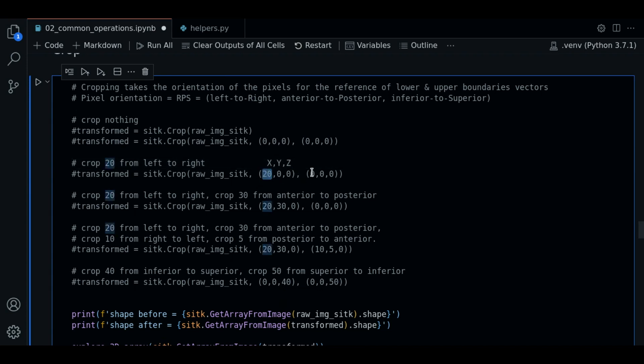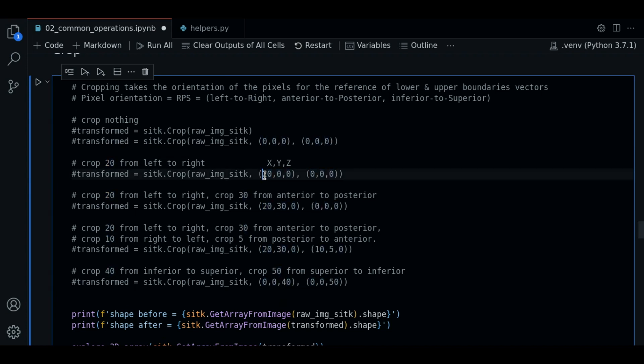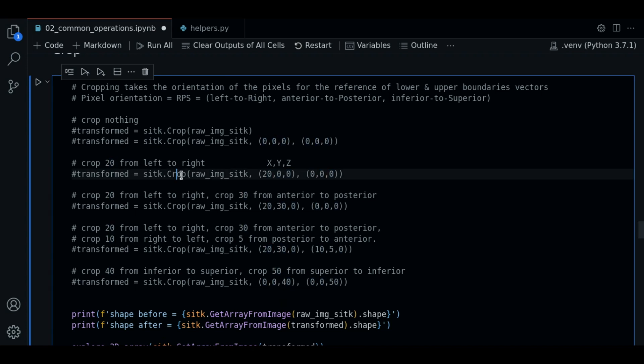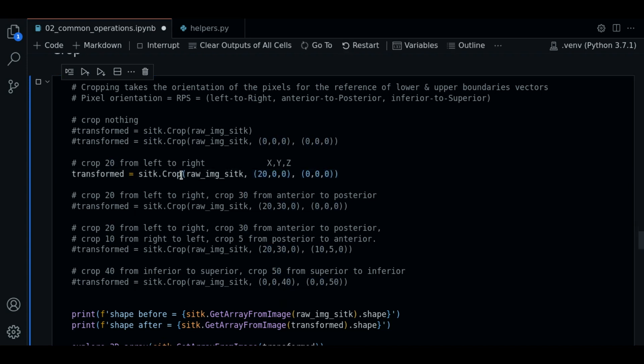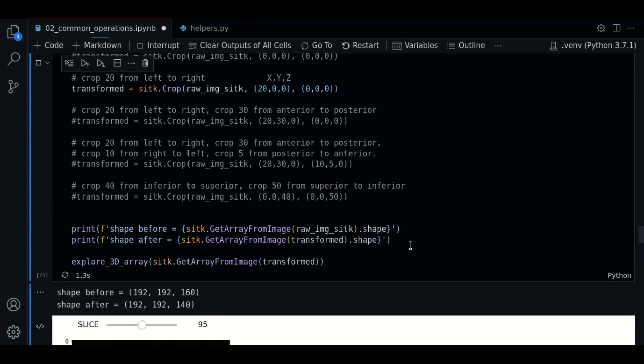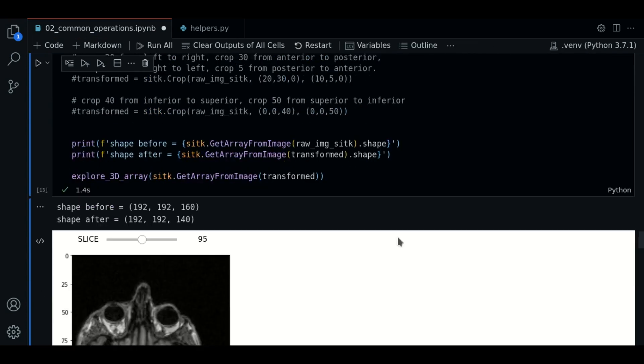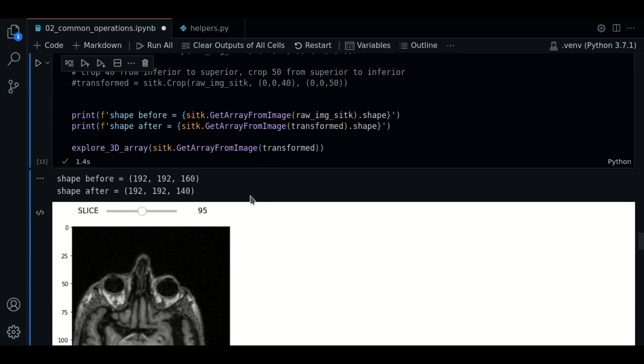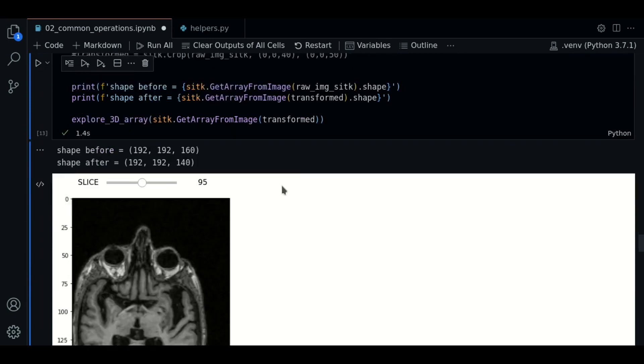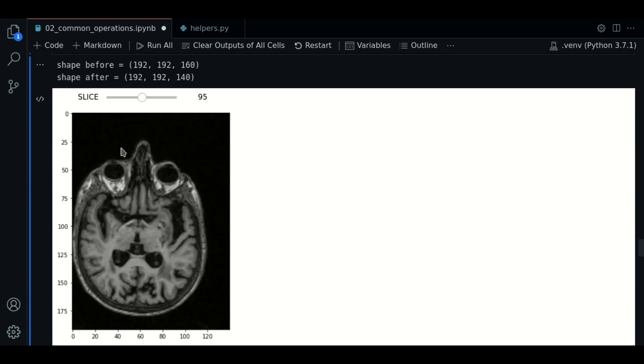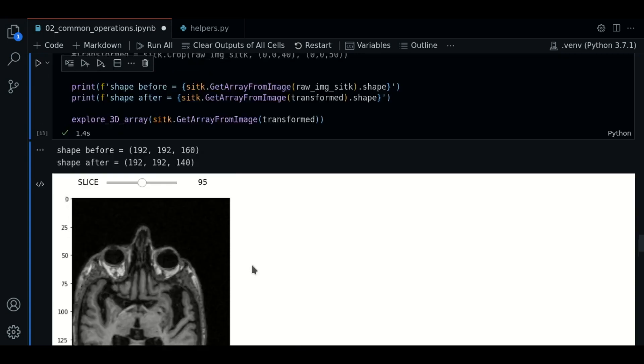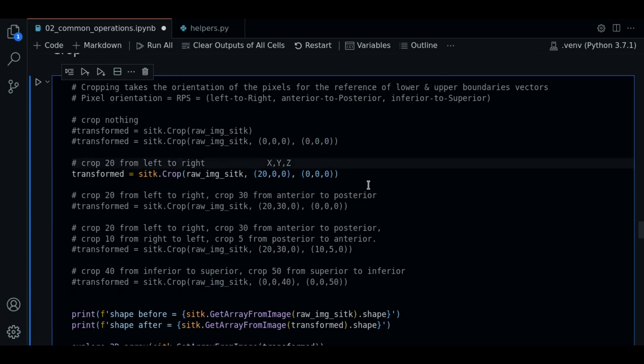As we only want from left to right we place zero values in the upper boundary vector. So let's see how this looks like. If we execute, as you can see now it is cropped from left to right. So now let's add more cropping.